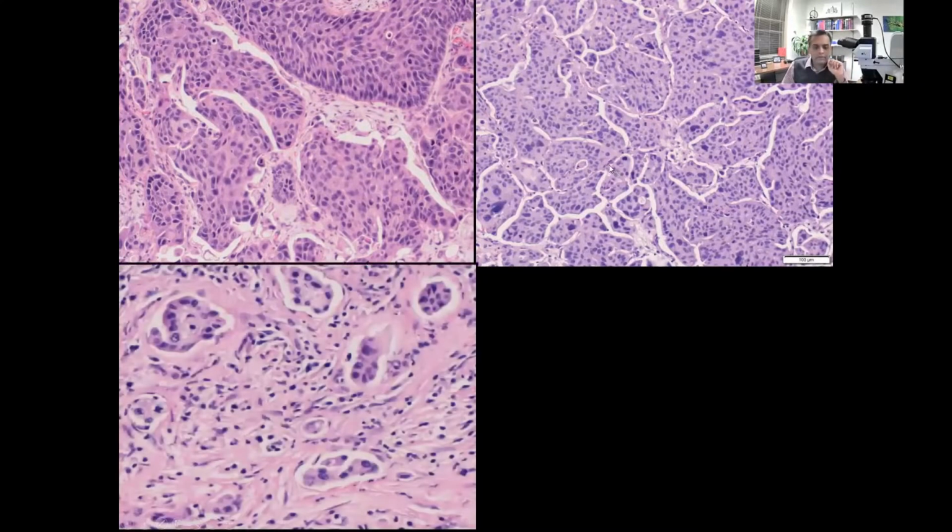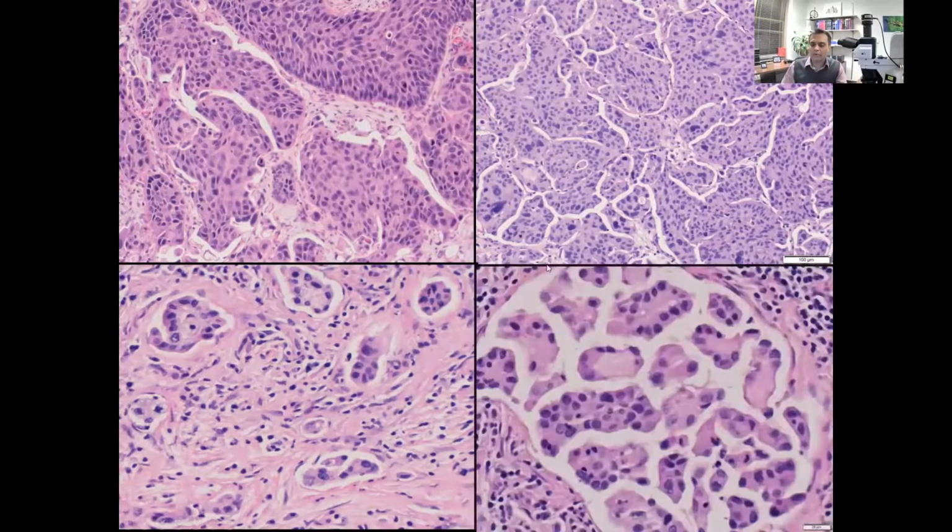Right, and another situation you may face is when you get these micropapillary or finger-like structures, but only one of them or a small cluster in a retraction space by itself, right? This is also not a situation where we should pull the trigger on micropapillary carcinoma, because this phenomenon happens in very many cancers, as we know. So the only situation in which you can confidently call something micropapillary is this.